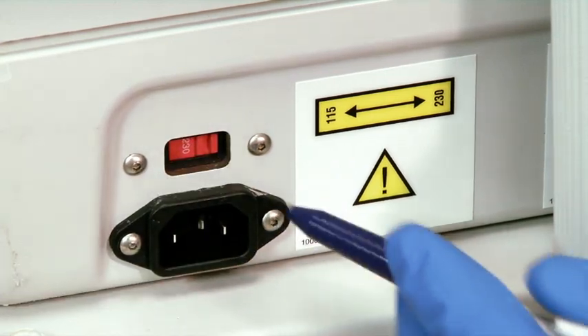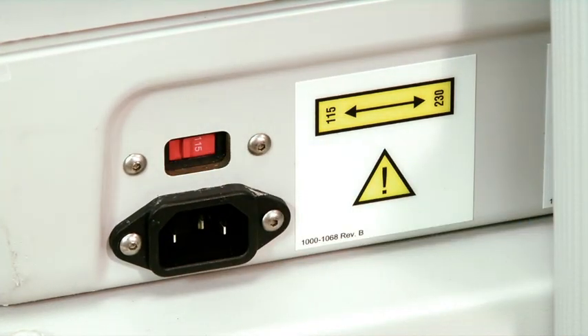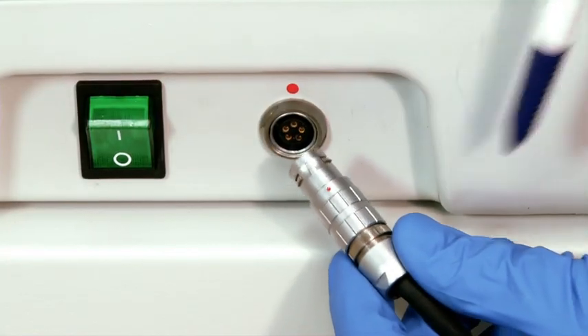To set up the console and the handpiece, first ensure there is proper voltage alignment between the outlet and the switch on the back of the console. Connect the power cord between the two and connect the foot switch to the console.